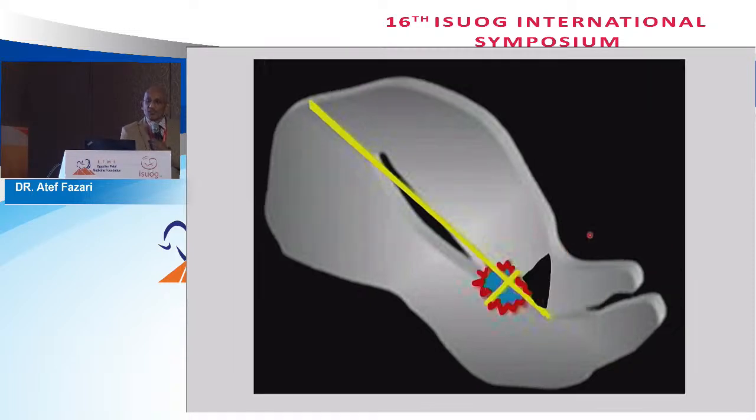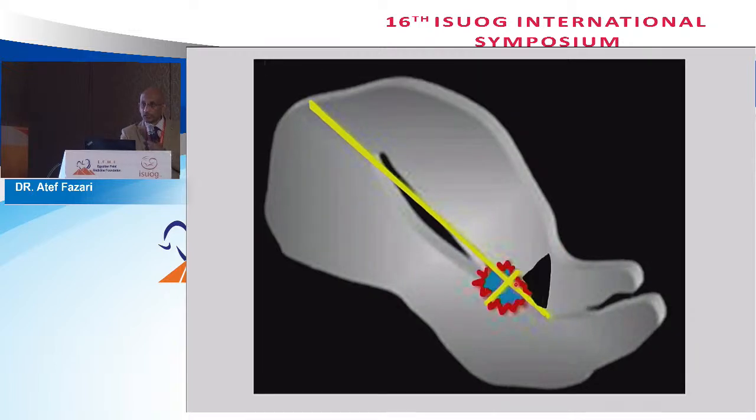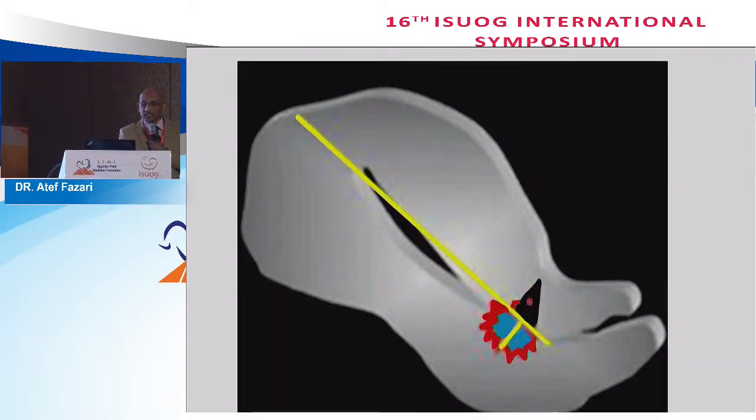Then the crossover sign type 2 plus, when 2/3 of the gestational sac is down, but there is still some remaining here. So most probably type 1 can go as exophytic and type 2 may continue as endophytic, but still attached. And the other one, type 2 minus, is still attached, but nothing is near or crossing. So all are really very simple, very easy. Just imagine the line and draw, and you can finalize which type of scar pregnancy you are dealing with.